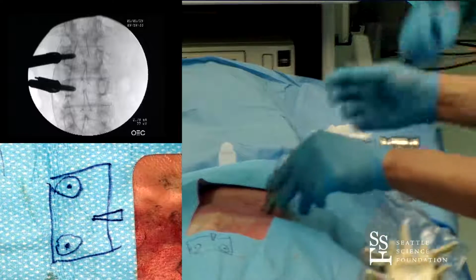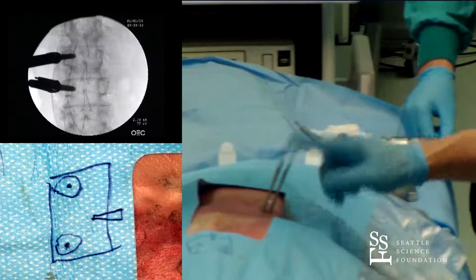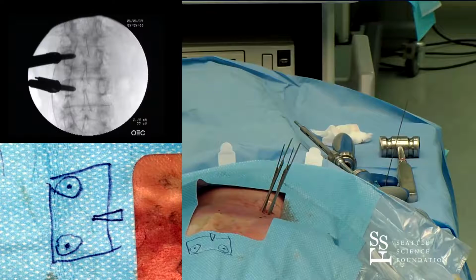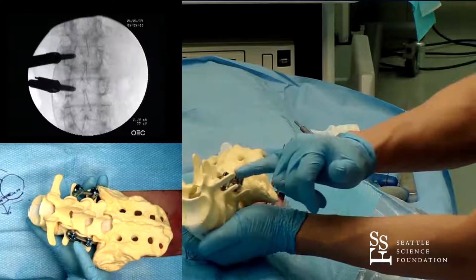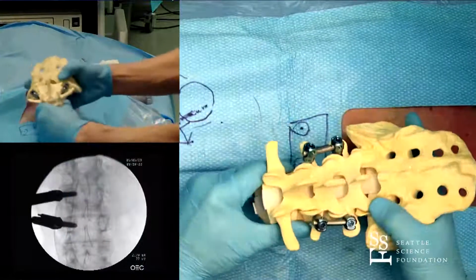Now, this obviously, we could do many levels. We could do this at 1, 2, 3, 4, 5, and you can kind of see how many levels that we could attack. I'll do one level. And this is the construct that we're trying to make. Ooh, let's see. There you go. Rod, two screws, and then if you see those two rods, how this becomes very rigid.